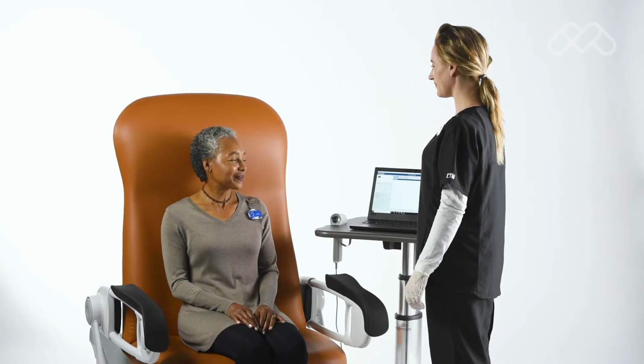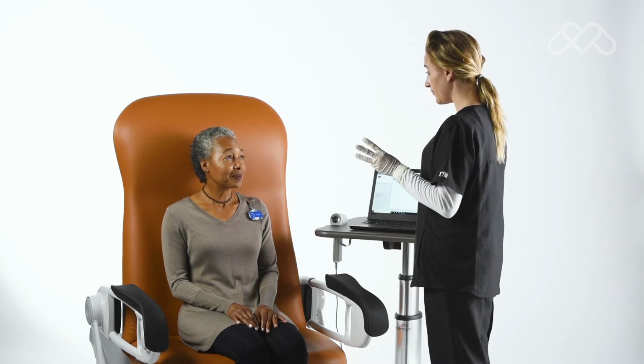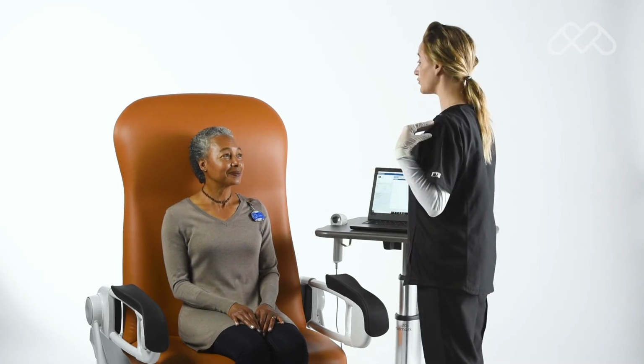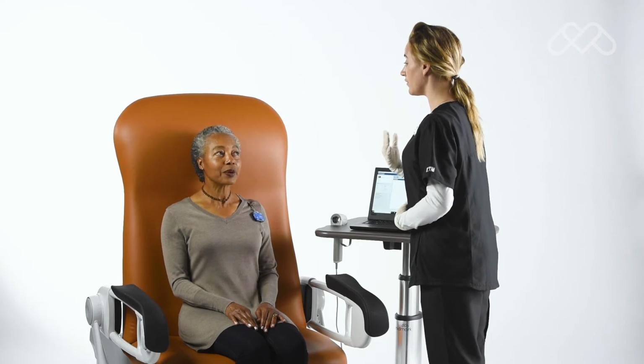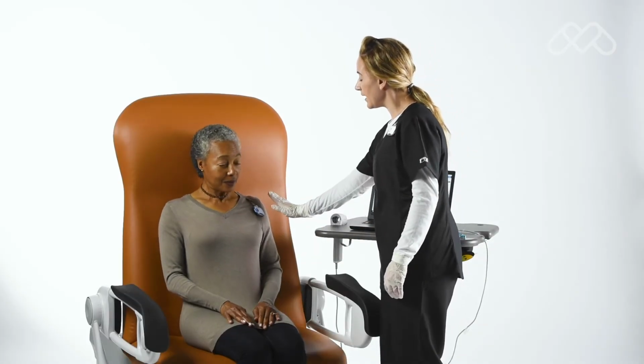Provide the following patient instructions. Advise the patient that you will be performing a minimum of 3 and a maximum of 8 testing maneuvers. Instruct the patient to keep shoulders back and the chin up when blowing, and do not bend forward as they exhale. Advise the patient that if they begin to lean forward, you will remind them to sit back up.